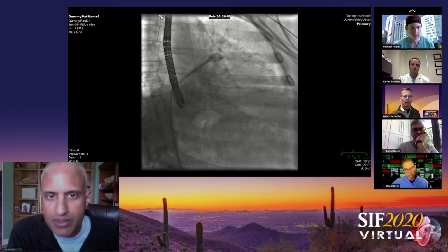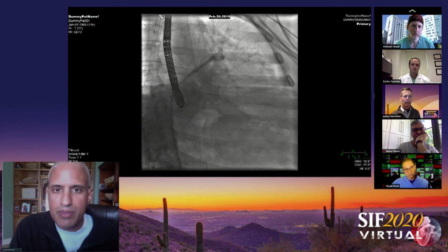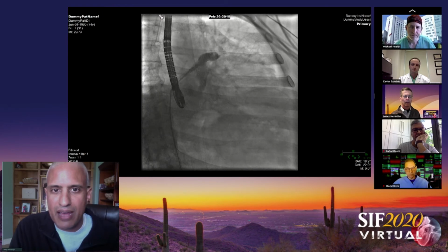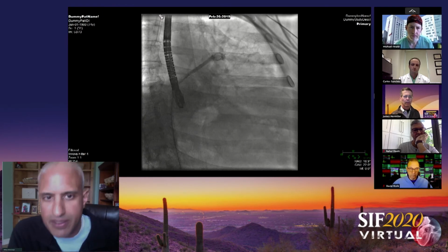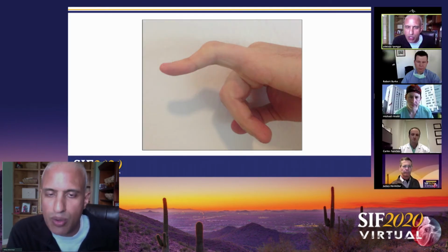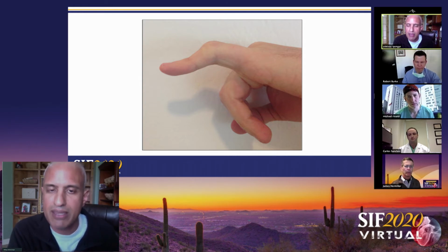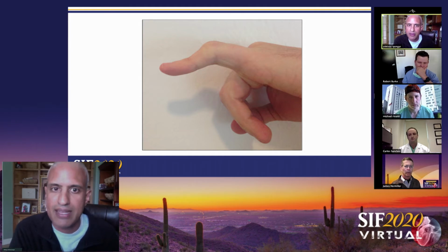Now that finger doesn't look as straight. And the picture that I can use to verify how that looks now would be this. So rather than that finger sticking straight out, there was kind of a hump in the middle of it. So if anything, that might have been throwing us off when we were trying to deploy the device. So that gave me a little bit more information. And the anterior curved sheath, for me, at least personally, gave me a little bit less flexibility on the catheter and less tension and torque that I was putting on the device.